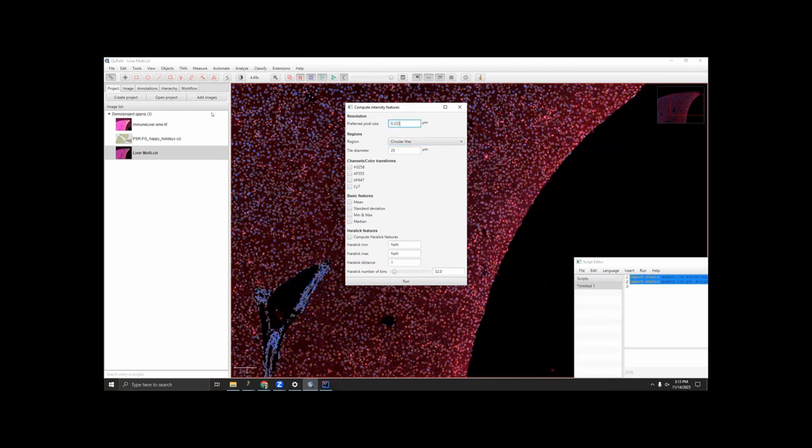And I'm going to use my preferred pixel size of the actual image pixel size, which in this case is 0.325. And I'm just going to select all the channels and select mean and hit run. Process all selected objects. Yes, hit OK. This will just take a second.